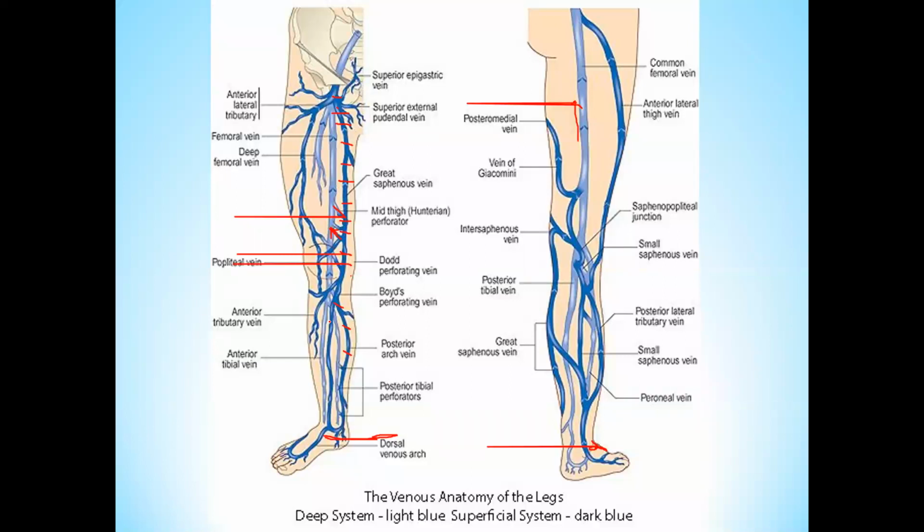You can check its bidirectional flow. In normal circumstances, there will be superficial to deep blood flow, but with transducer compression and sudden release, the blood will flow in reverse order from deep to superficial. In that case, it means the perforator is incompetent and dilated, and the blood is flowing in both directions, from superficial to deep as well as from deep to superficial.